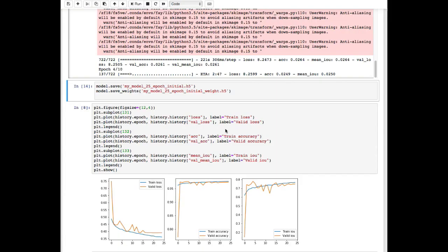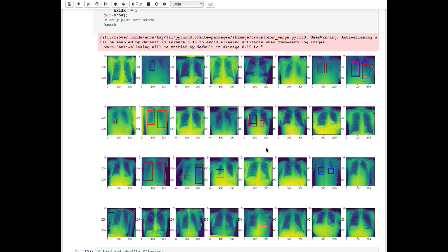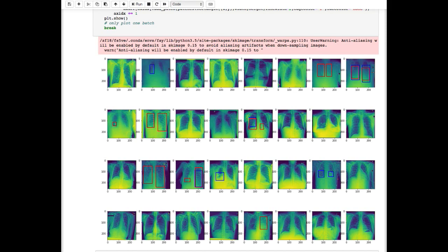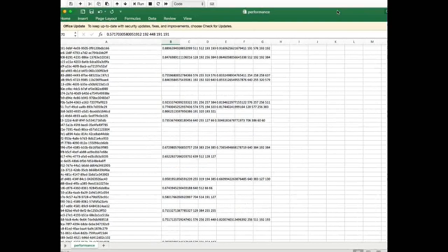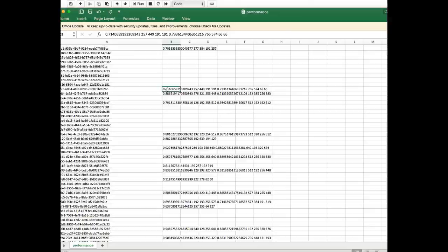Here we can observe the results of our model. We used the intersection over union (IOU) metric for calculating the model's performance, and we can see that after 18 epochs, the model's IOU value is equal to 72% on the validation data. The blue box indicates the ground truth bounding boxes of the pneumonia location, whereas the red one is the predicted one by our model. For most cases, our model's prediction confidence level is above 70%.